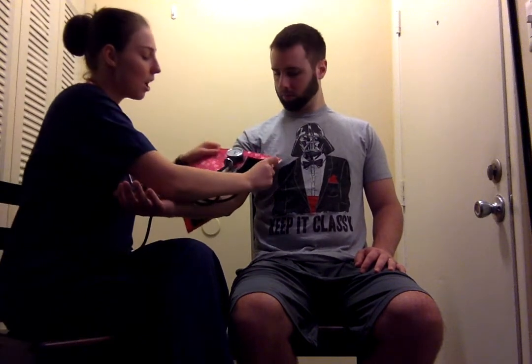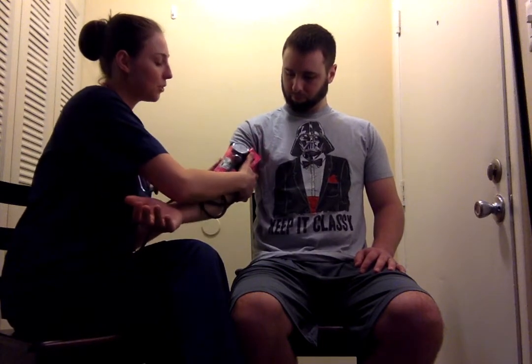Once our patient is ready to go, we're going to take our blood pressure cuff. We want to make sure our blood pressure cuff is the right size, because if it's too big or too small, it can give us an inaccurate reading. We are going to place it on the upper part of the arm above the brachial artery. We'll just wrap it around. We don't want to do it too tight, but we want to make sure it's on there snug.